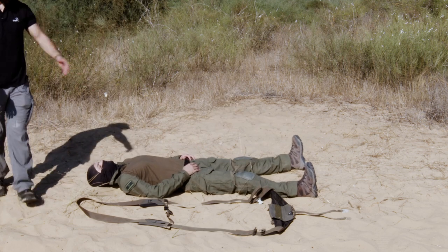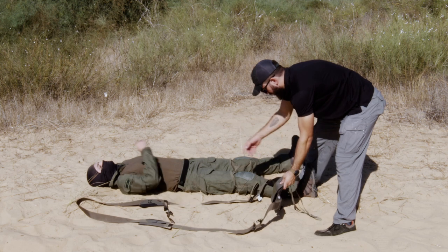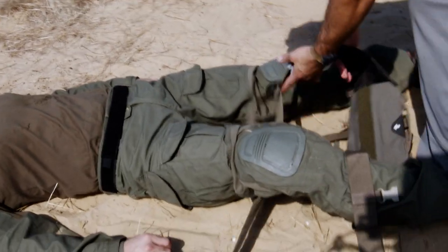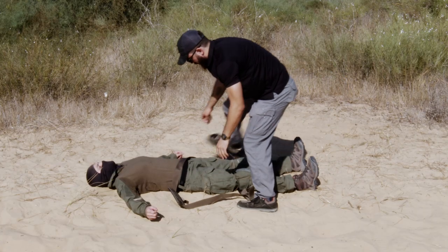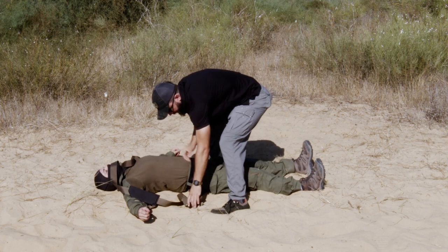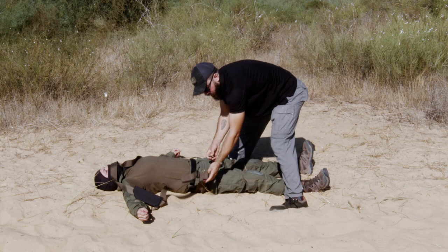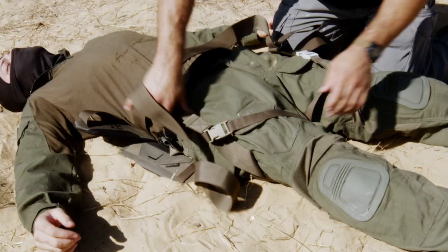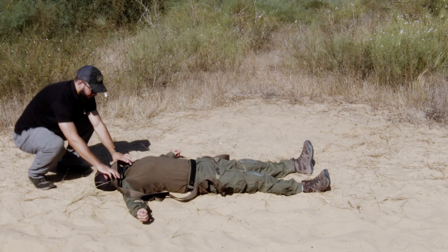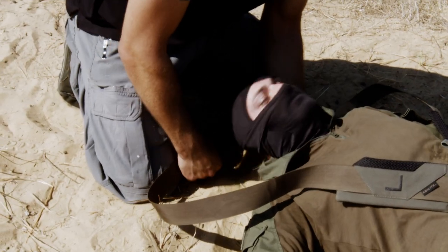Starting by putting it on a prone injured person. First thing is to get the butt pad under the butt. Get into position, grab his belt, lift him up a little bit and get it right in the right spot. Now these buckles are different colors so you don't get them confused — match the buckles to their colors. Now you have a butt pad secured in the right spot. This white bar tack marking shows how to put it in the middle of his back, under the armpits.